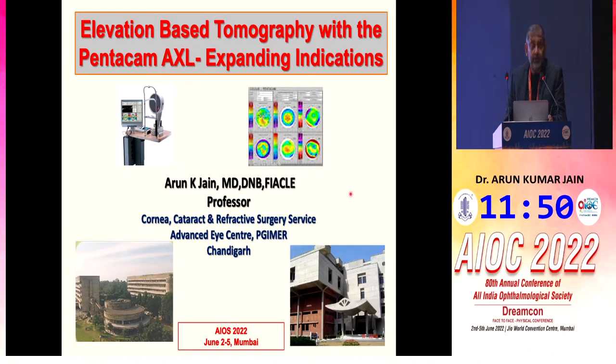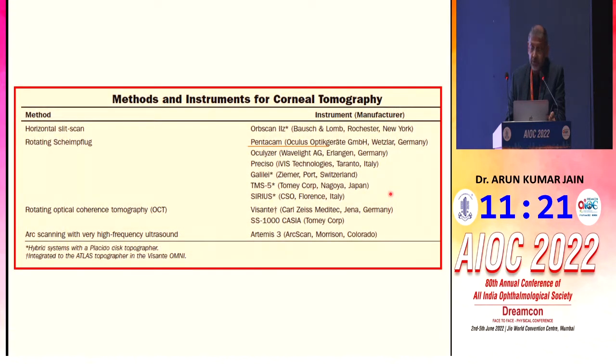I'll be talking about elevation-based tomography with Pentacam AXL. There are a lot of indications or a lot of problems where the Pentacam can be used, but I will be mainly restricting myself to the corneal problems and calculation of IOL power in post-refractive surgery. I have no financial interest in the subject matter of this talk.